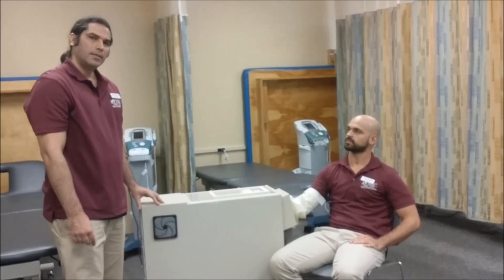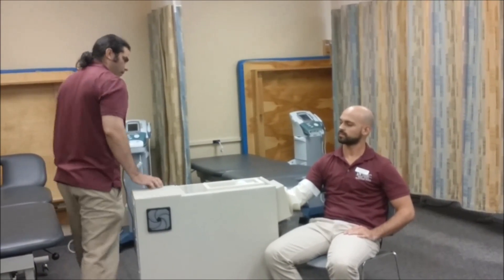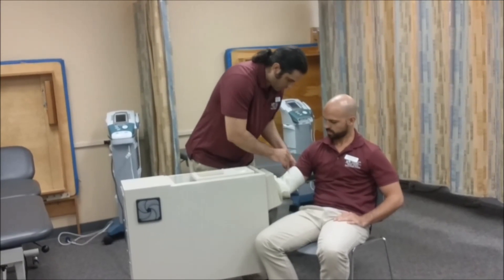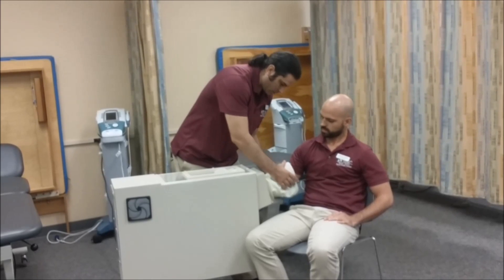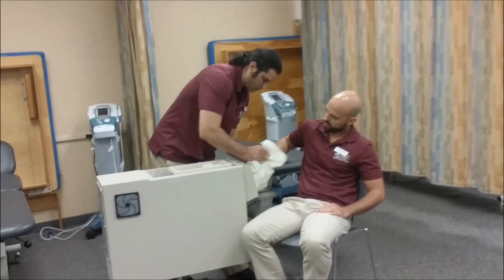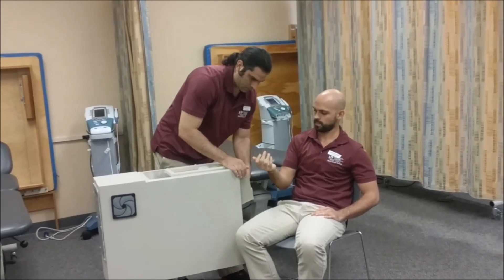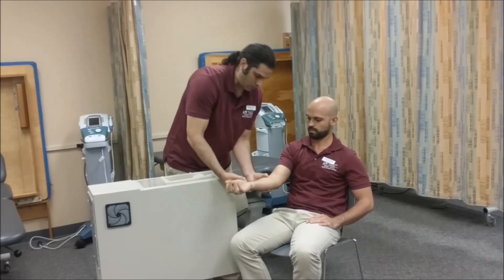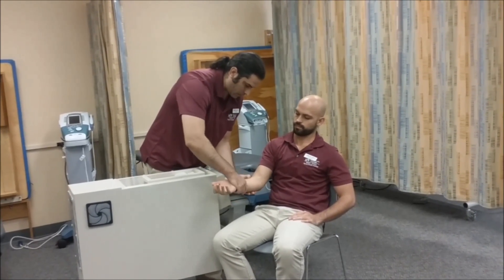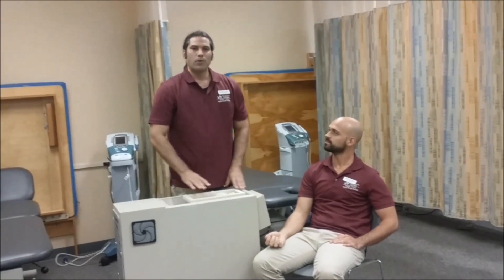20 minutes have passed. The treatment is over. Everything looks OK — I'm reassessing the skin. Everything looks fine. How do you feel? That was fluidotherapy.